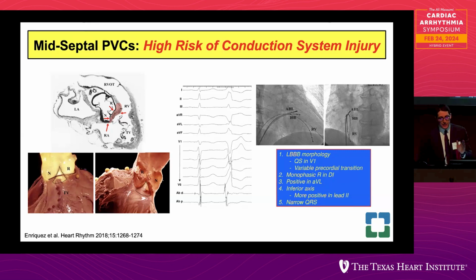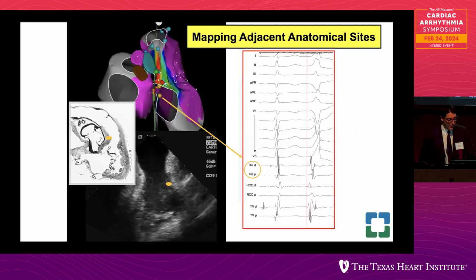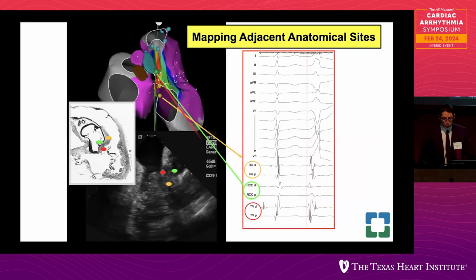And every systolic beat, the ablation catheter will shift backwards to the atrium. That causes injury to the conduction system, because every time you lose contact with the myocardium and go back to the atrium, you may injure the His. So the best and safest approach for this is to actually loop your catheter.